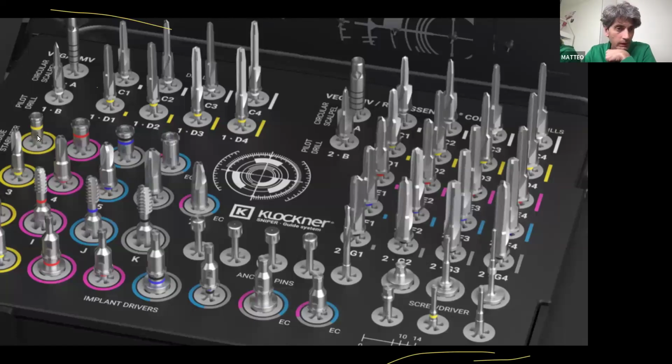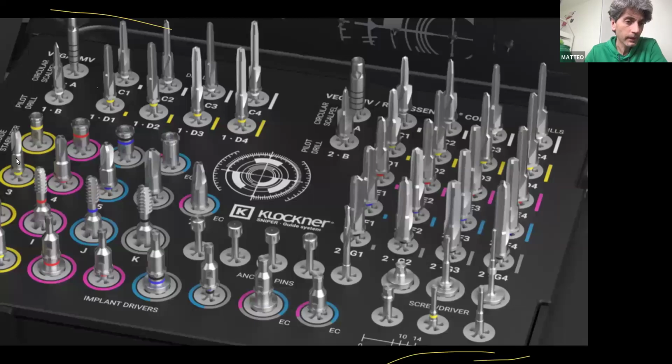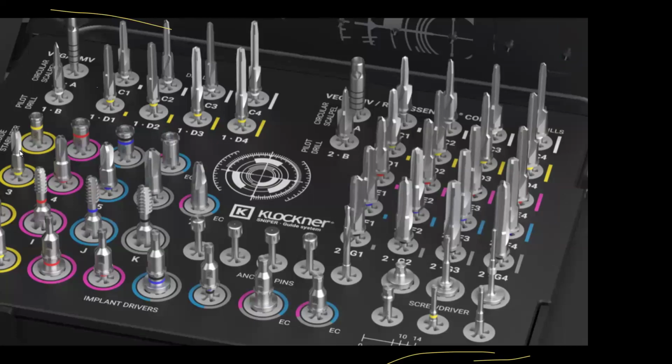Here you have some stabilizers. There are mounters, and you can place the implant with these mounters. You can leave the mounter or stabilizer in place once you place the implant, just to stabilize the guide. Perfect. Here you have the countersink drills for the cortical bone.